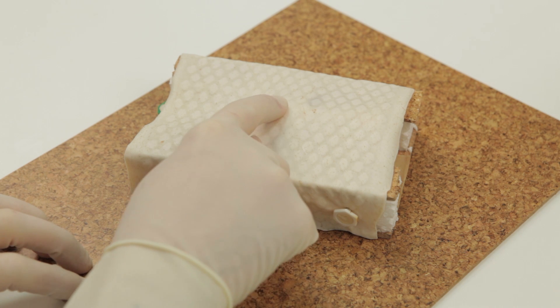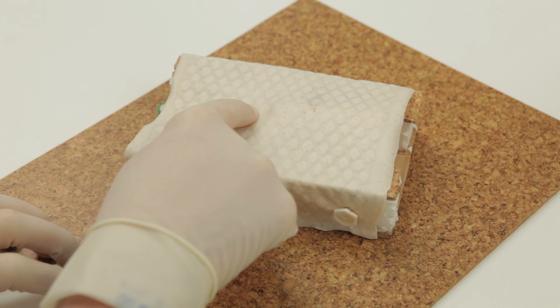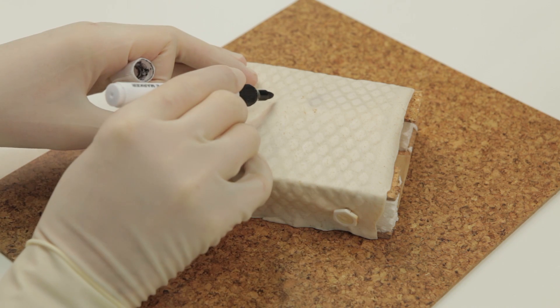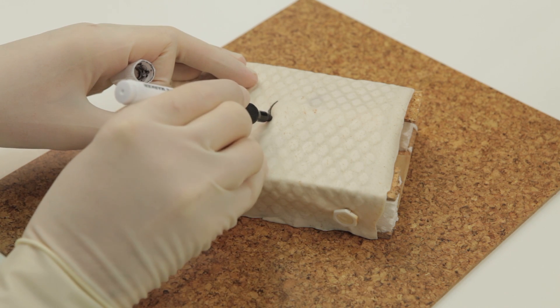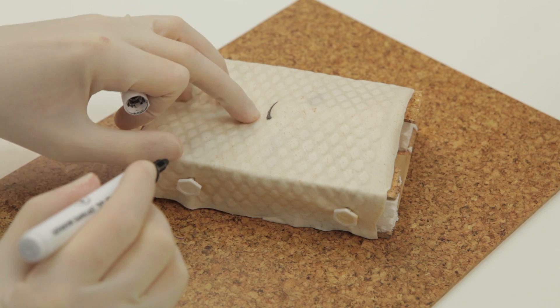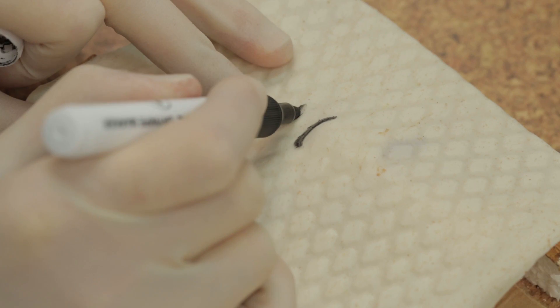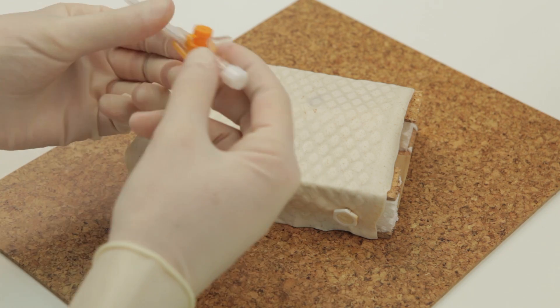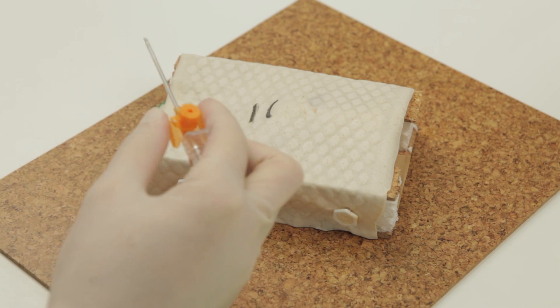In this station, we will demonstrate how to perform a needle cricothyroidotomy and emergency tracheostomy. This represents the thyroid cartilage, and this other line represents the cricoid cartilage. In between these two marks is the cricothyroid membrane.